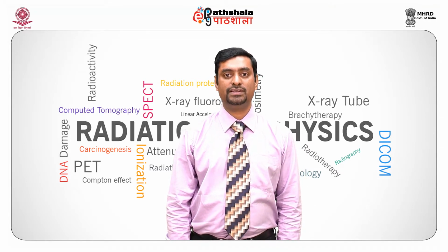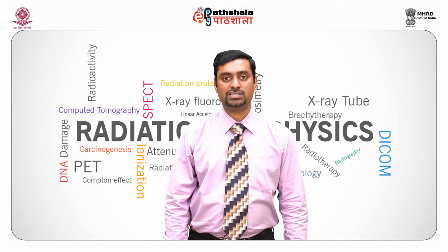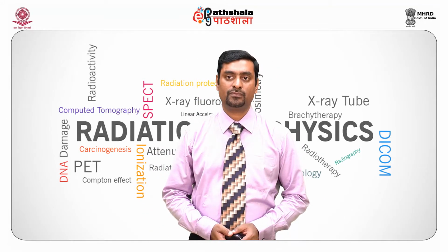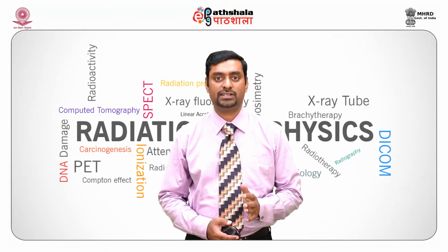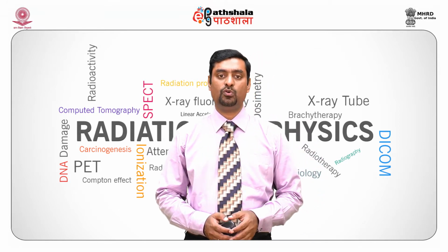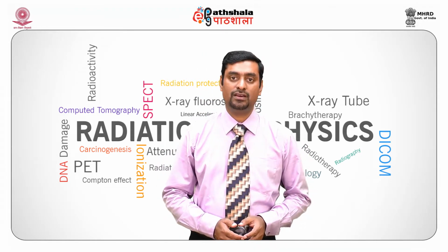Next, we move on to digital mammographic detectors. These kinds of detectors are currently used in various hospitals. As film screen radiography is getting outdated, we are slowly moving into computed radiography or direct digital radiography devices. The digital mammographic detector overcomes the film screen limitations by adopting optimized image processing algorithms with wide exposure latitude and contrast resolution.